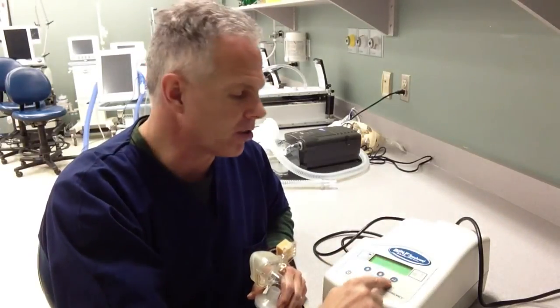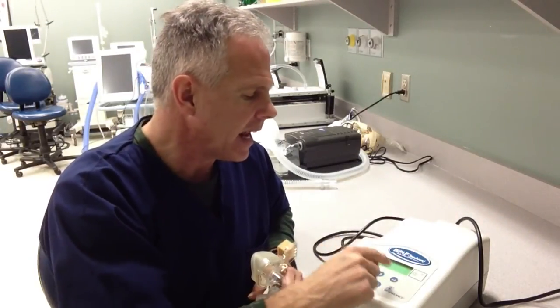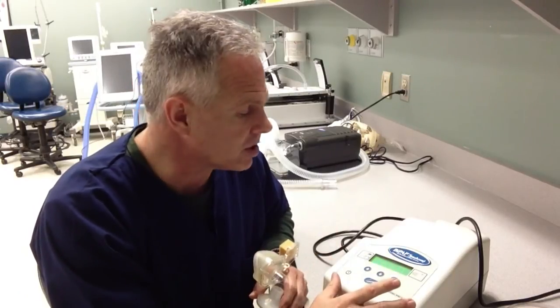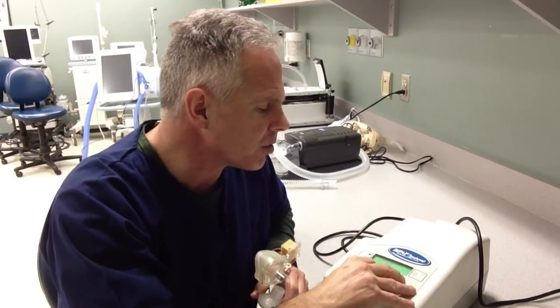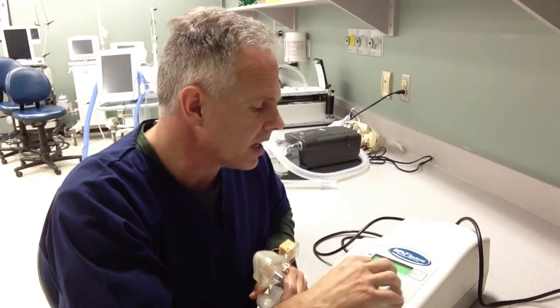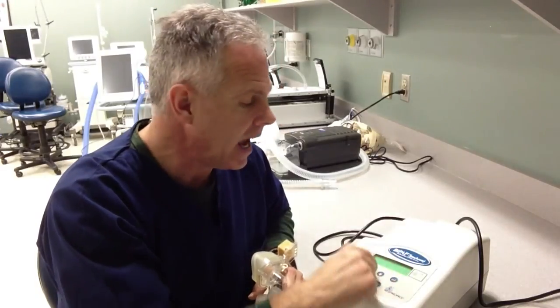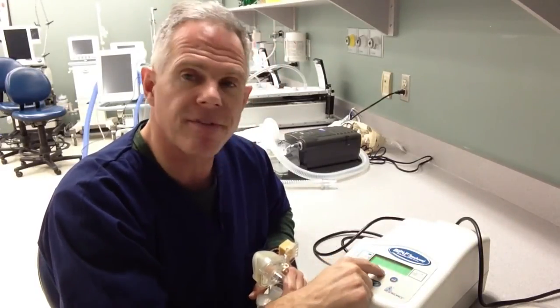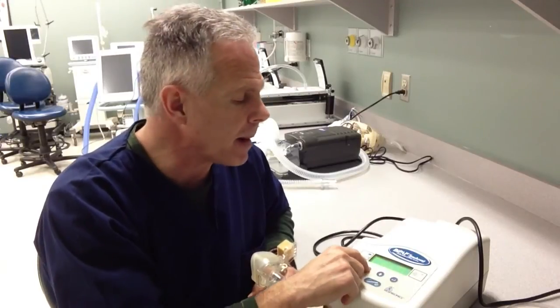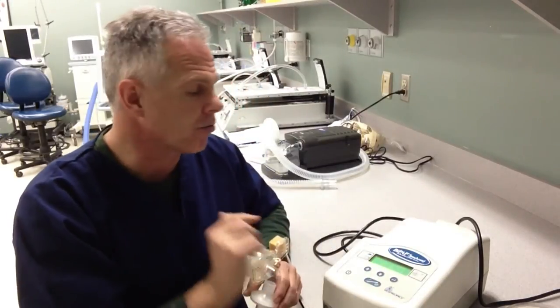Using the return key on the parameters and then the return key again, I can now adjust the level of IPAP or EPAP being delivered by the device. You just have to get in here and play with it a little bit — you can't hurt the machine. Right now I've got it set at 10 of inspiratory pressure. I'll use the return key and now I can set the EPAP pressure to 4, 5, 6, or whatever is required by my patient. I'm leaving it at 4 for myself right now.